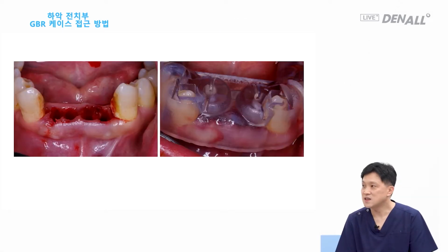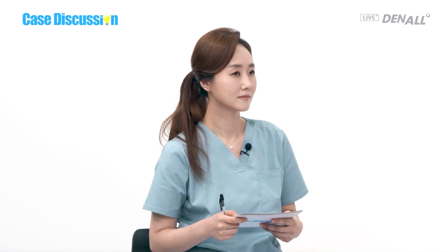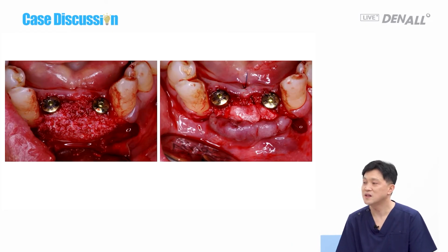success rate. In the past, we would do the staged approach, delayed approach, and the submerged case can turn into one-stage surgery. So implants were placed first. When I treat the lower anterior region, the residual bone you see here, we cannot expect the bone to remain like that after loading. CT is checked whether the implants are positioned precisely. Personally, for anterior regions, when I do bone augmentation, I use xenograft, which is slow to be resorbed. During GBR, even though the implants are in the bone housing, that is necessary.